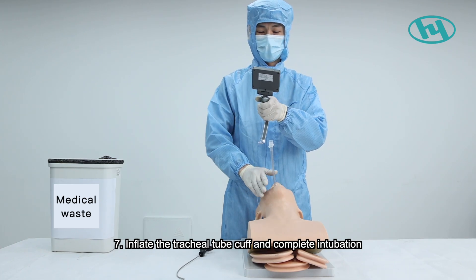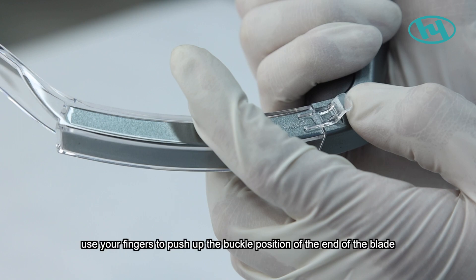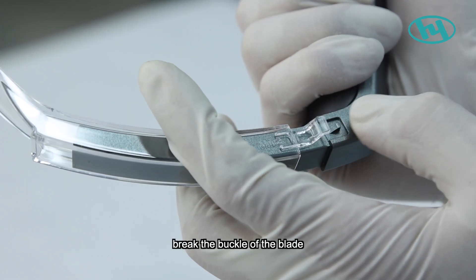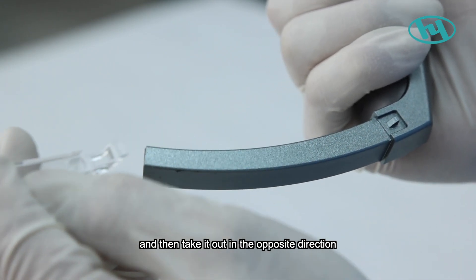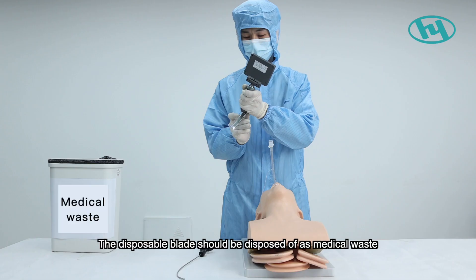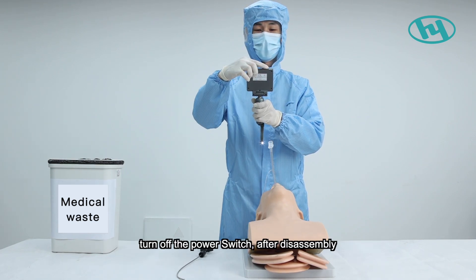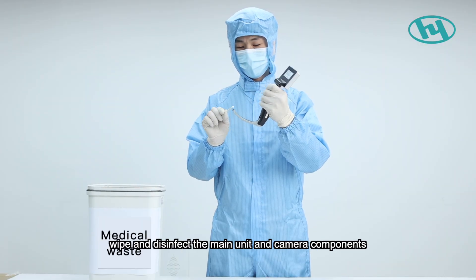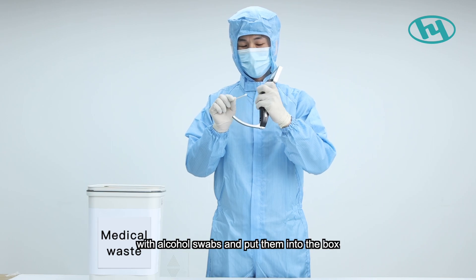Step seven, inflate the tracheal tube cuff to complete intubation. Step eight, after intubation, push up the buckle at the end of the blade to release it, then withdraw the blade in the opposite direction. Dispose of the single-use blade as medical waste. Turn off the power switch, then wipe and disinfect the main unit and camera components with alcohol swabs and store them in the box.